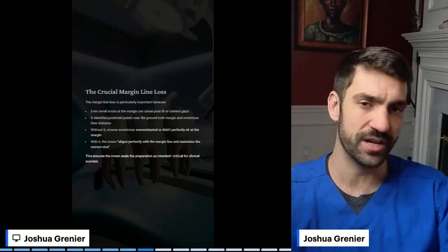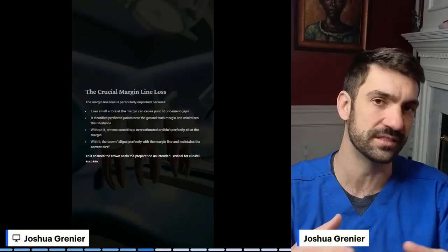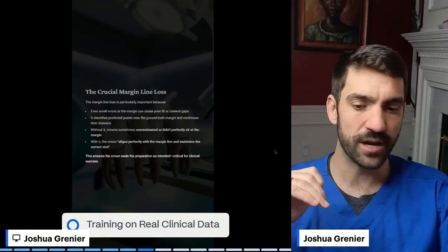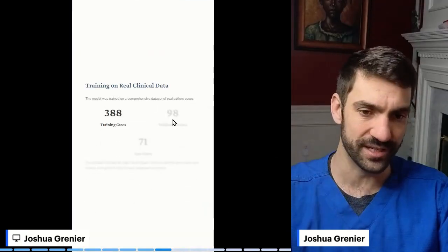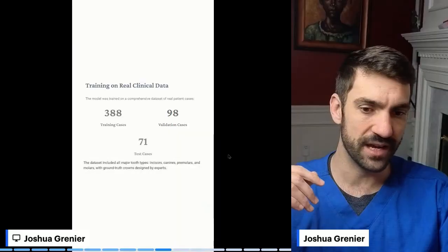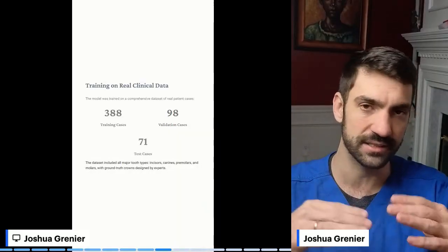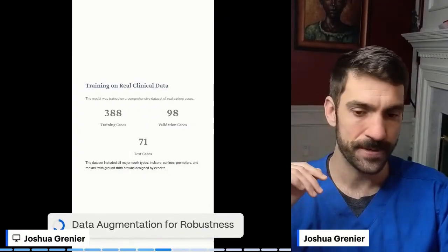So I really question how well this sort of data, again, this was just academic, how well this type of approach is even going to stand up to real world problems. And very low training cases, only 388, can't blame them. And they validated it, used a few test cases. They'll divide the training cases up into different batches and test how well these types of things work.